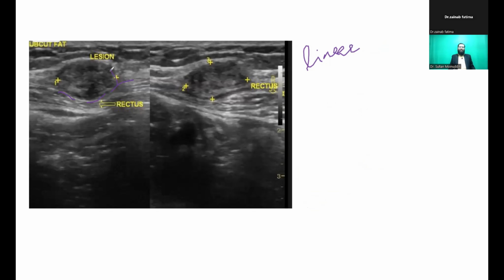So in para-umbilical region, this is a heterogeneous appearing. I'll change the color. So this is the rectus sheath, and in para-umbilical region, you are able to see this heterogeneously hypoechoic area, which is there. And on FNAC, you can do a fine needle aspiration cytology of this. This turned out to be endometriosis, and patient was complaining of cyclical pain in this region.